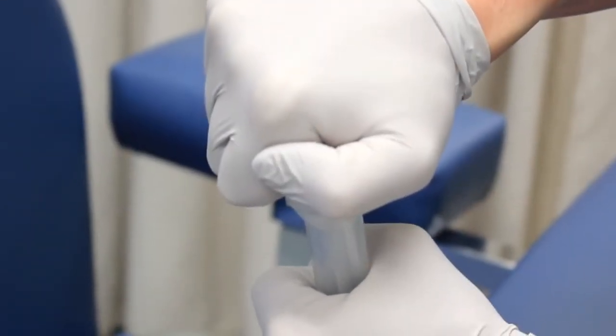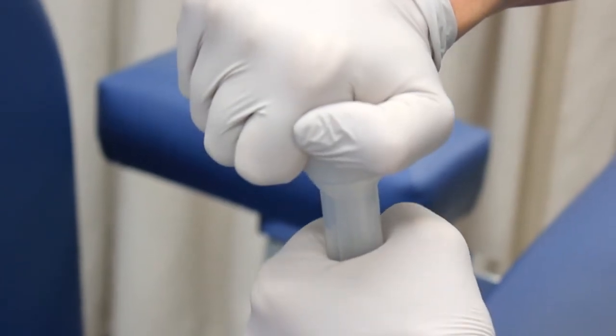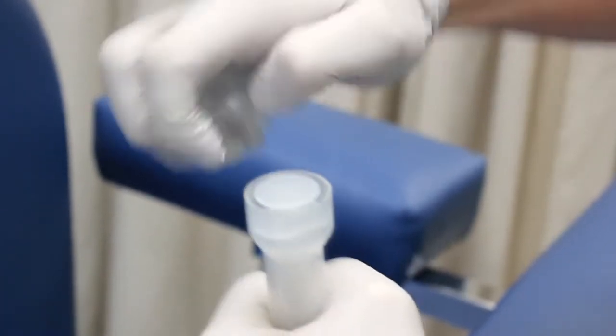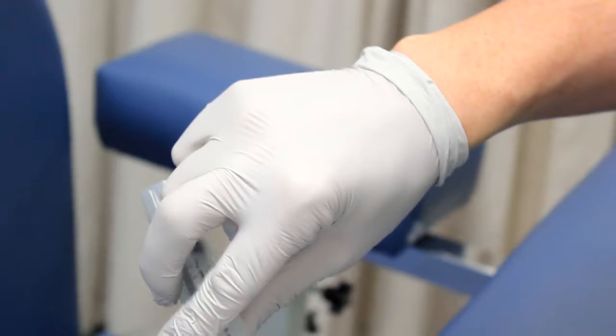To open the syringe, twist the top of the plastic container to snap the closure. Remove the top and pour the syringe into your hand, taking care not to touch the exposed end.